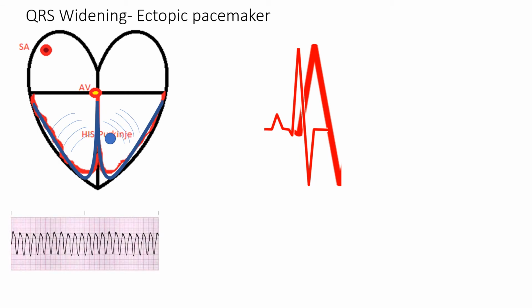If I have a single pacemaker repeatedly sending the stimulus through the ventricles, I get a monomorphic QRS, since the depolarization looks the same each time in the same lead. And when this is occurring at a rate greater than 100 beats per minute, I get monomorphic ventricular tachycardia.